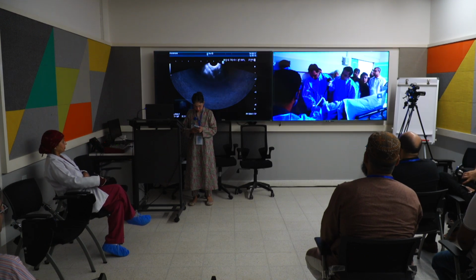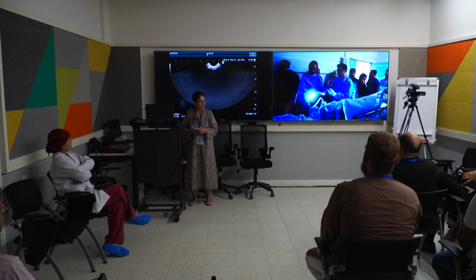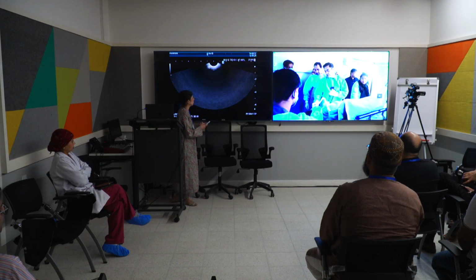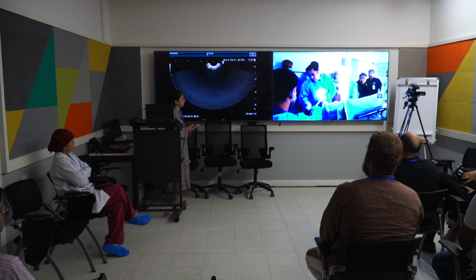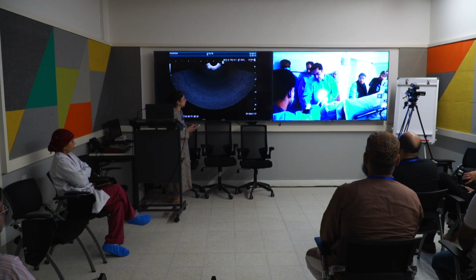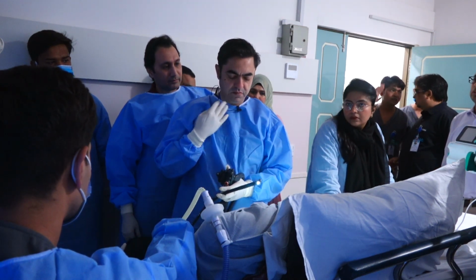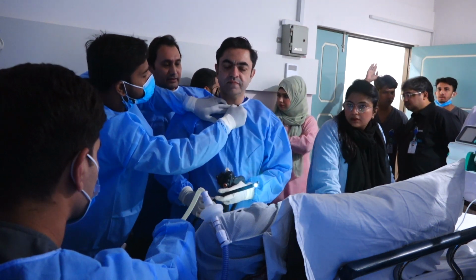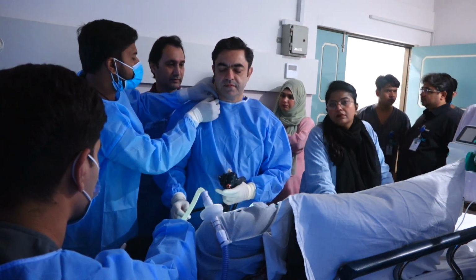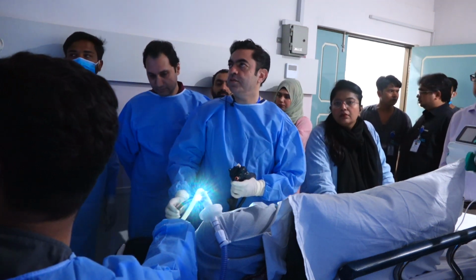Okay, let me have a look, this is an Olympus scope, right? Fuji. So what I tend to do is move the scope up and down. Chin down please. Shahzad, can you put your mic on the right? Because you are going to keep turning to the right. The mic on the right. Can you hear me now? Yes, very well.